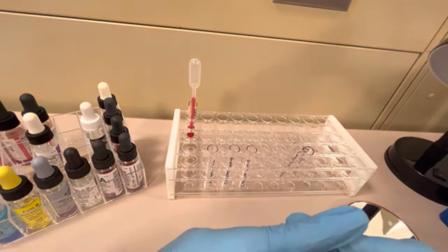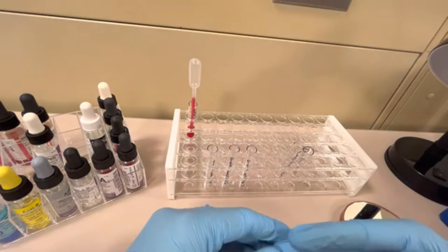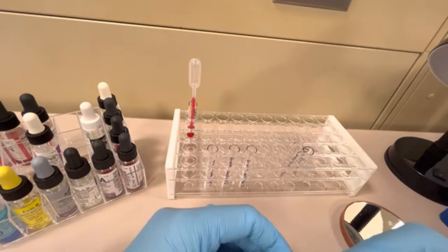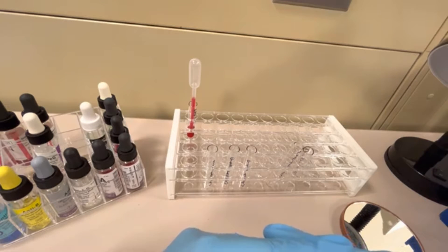Cord blood contains Wharton's jelly, which is kind of this gelatinous substance that is present in the cord blood that helps to insulate and protect umbilical blood vessels. That Wharton's jelly can actually interfere with blood bank testing. So we have to wash these red cells.